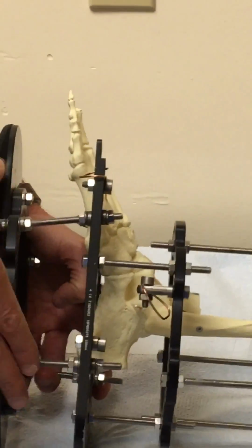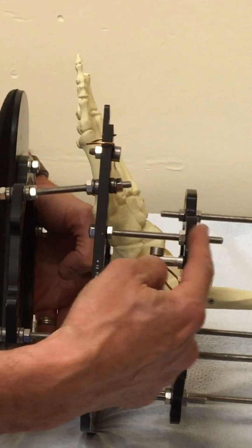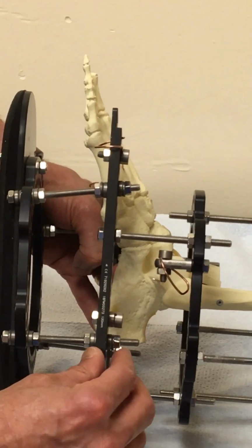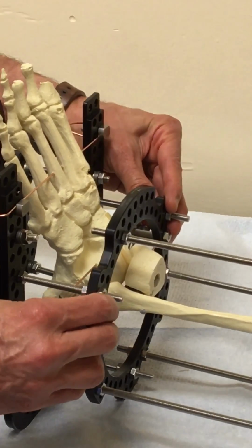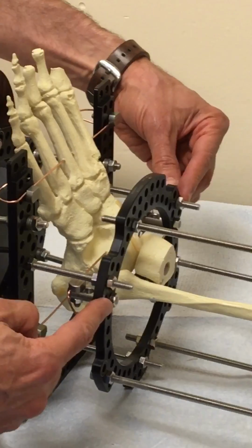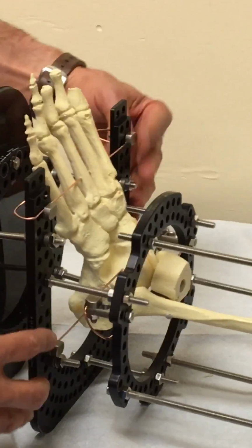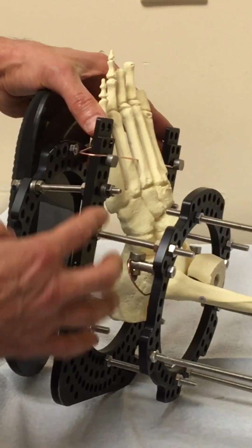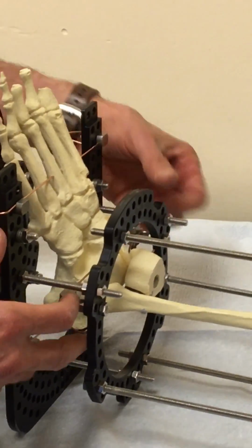So imagine this is a way, okay? You have distance that you can change here by changing these threaded rods, these 3 threaded rods that connect the foot plate to the distal tibial ring. But really, in the distal tibial ring, you're just going to have 1 wire in the talus, and I recommend hooking up this wire to this ring. And then the real strength of everything distally comes from the connection onto the foot with 5 wires in the foot, 1 wire in the talus. That's all your distal fixation.